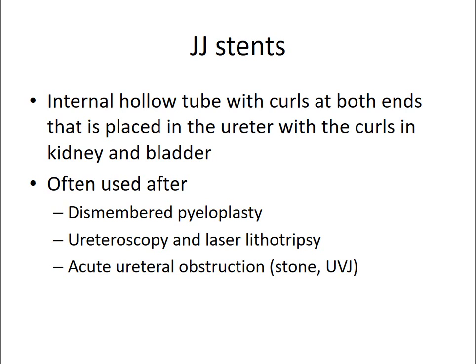And then for children in whom we have an episode of acute ureteral obstruction, whether it be related to a stone or a stricture or a congenital blockage of the ureter, and we want acute drainage and are planning a subsequent intervention.